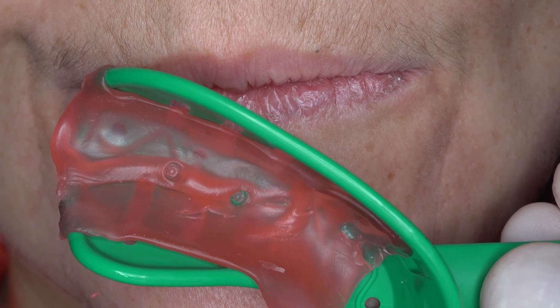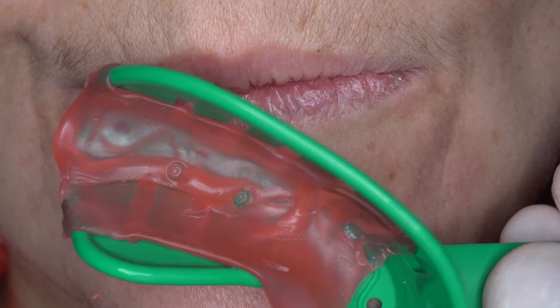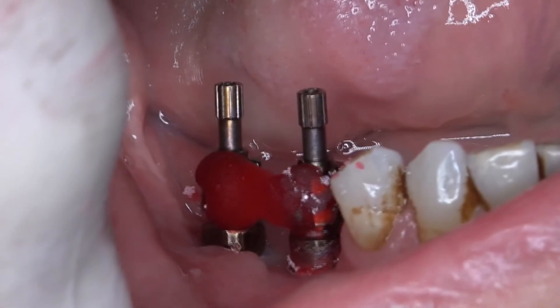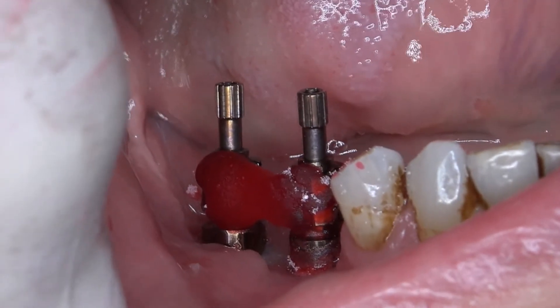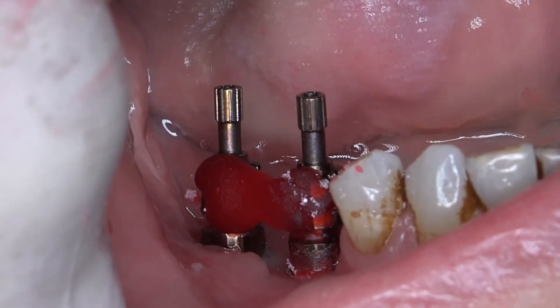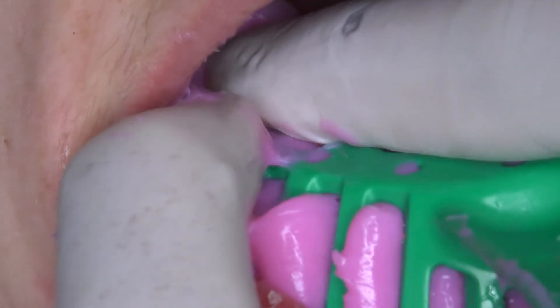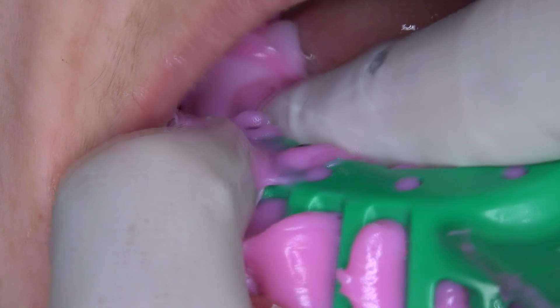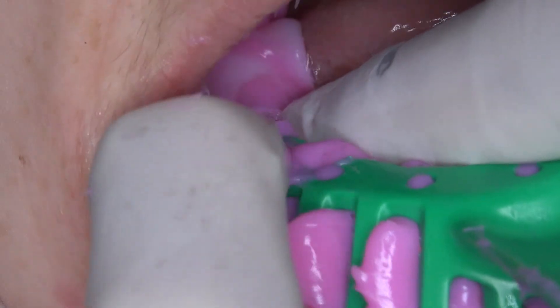2 mm diameter holes are opened on these prints. Then the posts are splinted to each other by a resin with the dipping method, and impression making is completed using a silicone impression material.